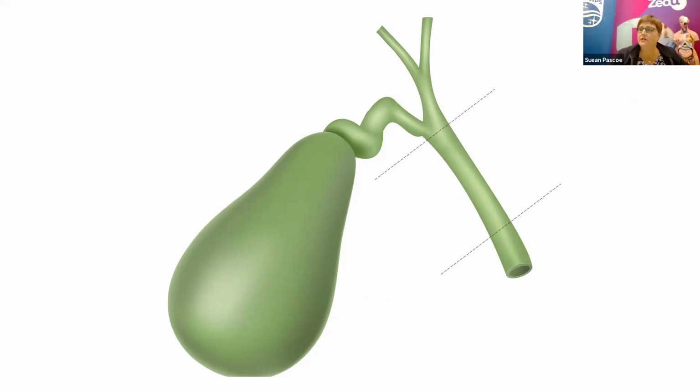So we're looking at this segment all the way to the pancreas. As I was looking for pictures to illustrate how I go about scanning it, every single picture I found presented the gallbladder and the bile duct in this orientation. I'm thinking through the angle my hand is at, and where the probe is sitting on the body, and for the life of me I couldn't marry up why this looked so vertical, because when I finally get to the common bile duct view, I'm almost transverse on the patient. I was trying to find an image that would illustrate that, but the textbook anatomy just didn't do it.